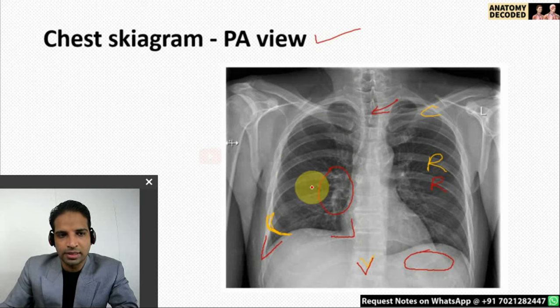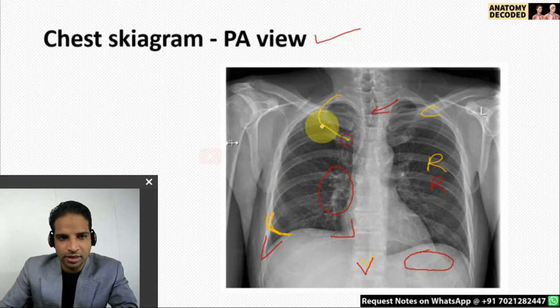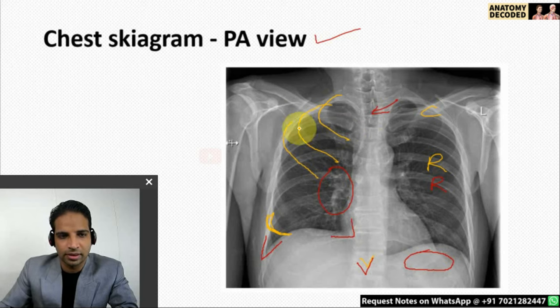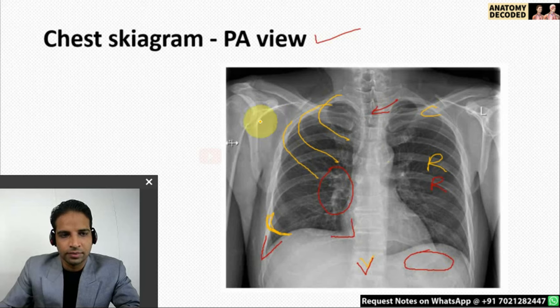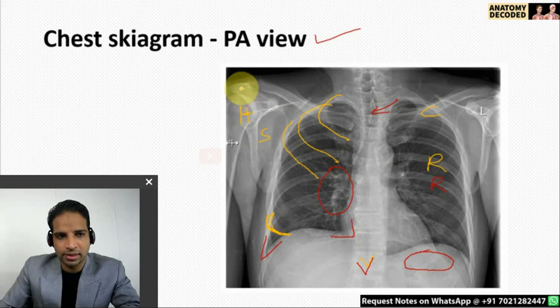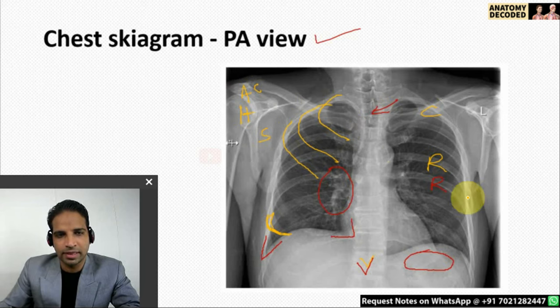Counting of the ribs is important. The first rib, second, third, and so on — we count from posterior to anterior aspect, which is the ideal method for counting ribs. The scapula is also visible here, and the side of the humerus. The lateral end of the clavicle articulates with the acromion process of the scapula. All these structures are what you need to mention in the exam.